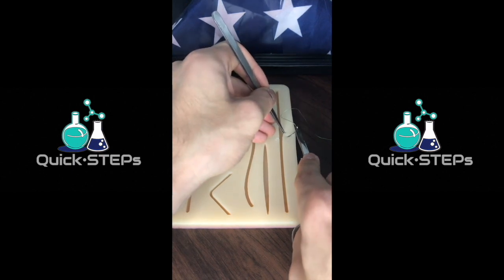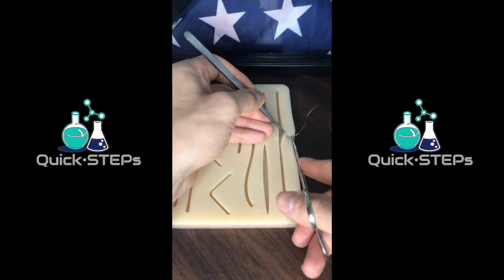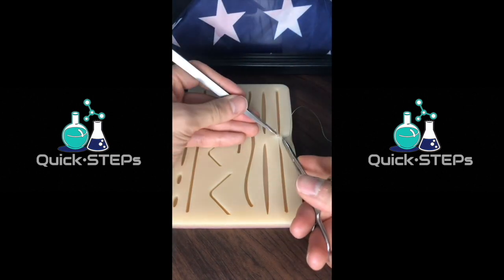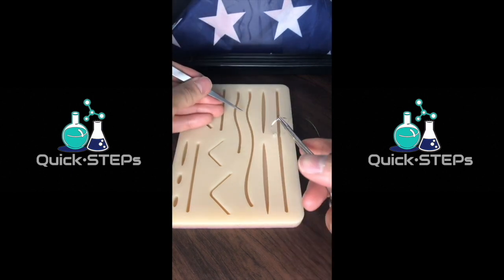Grab a hold with the forceps, a nice little bite of skin, insert the needle, make sure your hand's perpendicular to the skin, rotate your wrist until the needle tip's through, go to the other edge, rotate again until the needle's through. Rotate your wrist again and pull out.